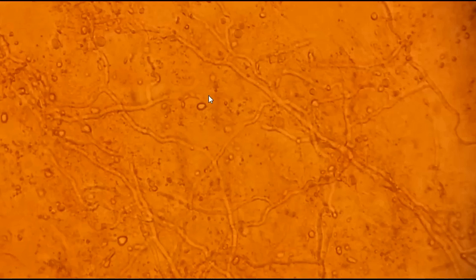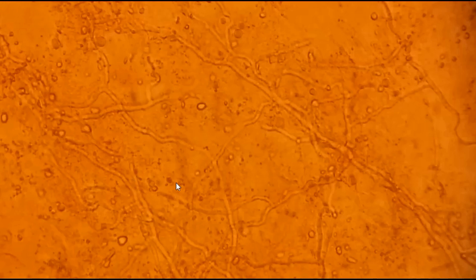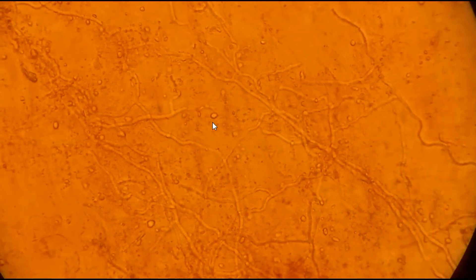Let's learn about potassium hydroxide (KOH) preparation of skin scraping. Here you can see branching hyphae — this one, this one, this one. These are all hyphae.